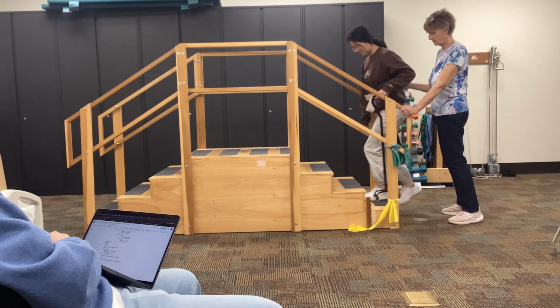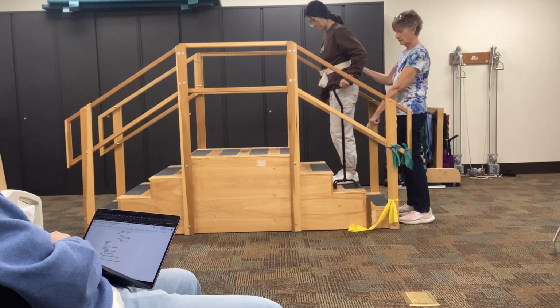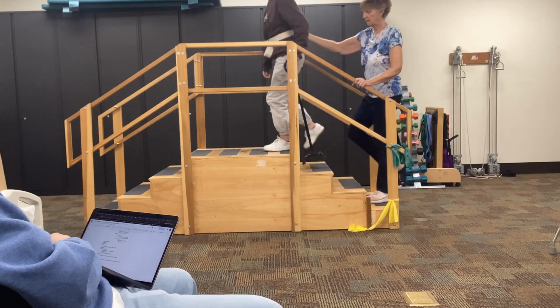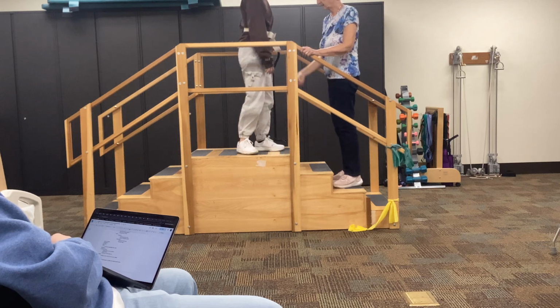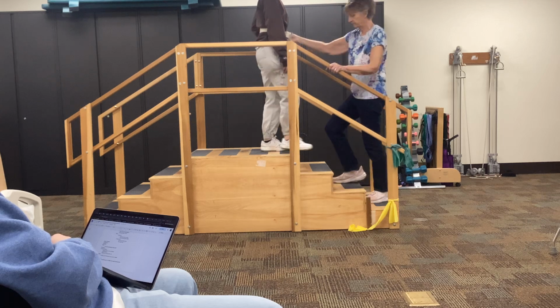Okay, same thing. Okay, now you just have to make sure that all 4 points of the quad cane are on the solid surface. Okay, one down. Same thing as she was turning around, almost came to the edge there. All right.